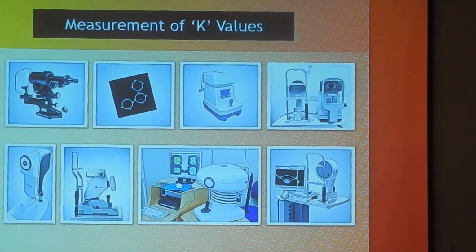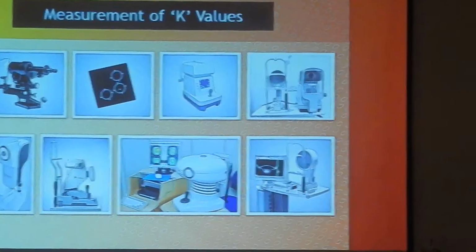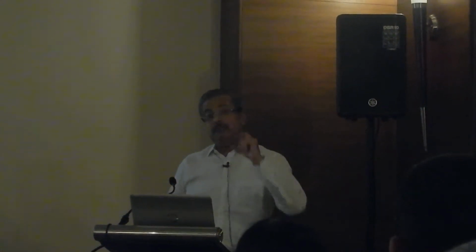So if you keep on seeing the astigmatism as it naturally occurs, as you go to the periphery, it tends to widen up. So you cannot depend on that, and you look at more or less between the 3 to 5 millimeter zone. Your optical biometers are excellent because they come closer to the cornea. Wolfgang Haigis taught us that central paraxial measurement of the corneal curvature is probably the most accurate method to look at it.